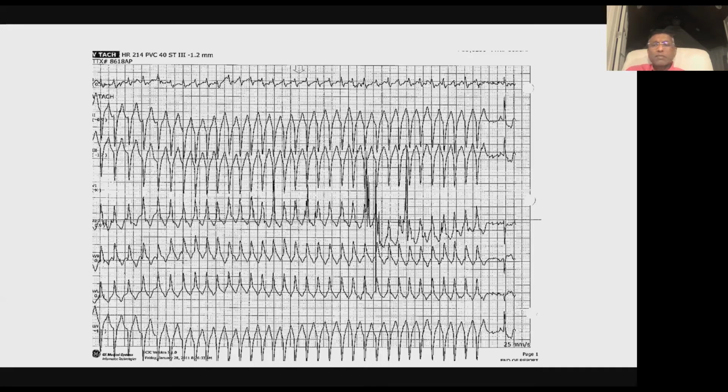Okay, good start. So you started saying something about sinus and that you could see some P waves. And I was trying to see which ones you were talking about. In which lead are you seeing P waves? From the bottom, the third lead. Okay, this lead here, on the left? Yes.